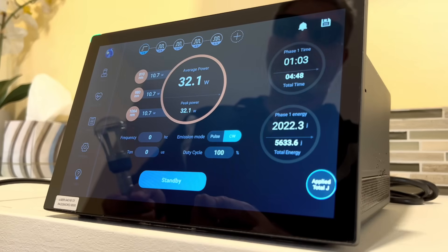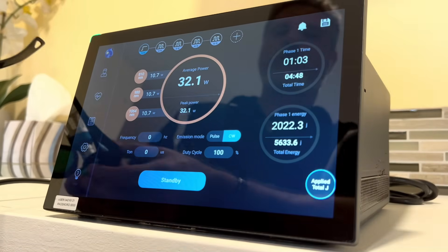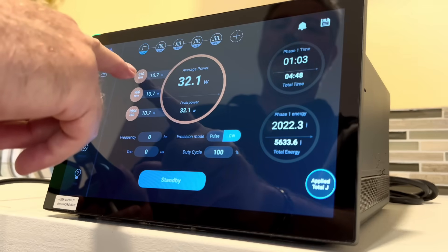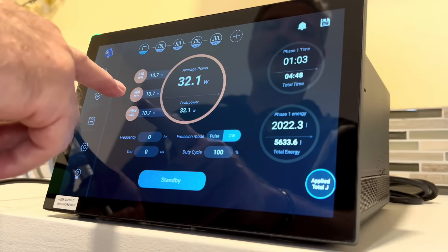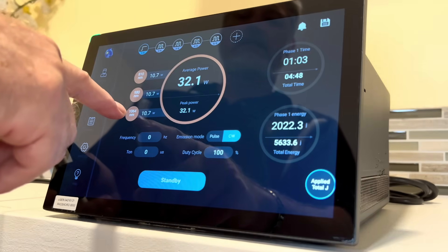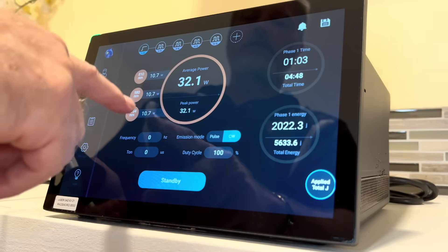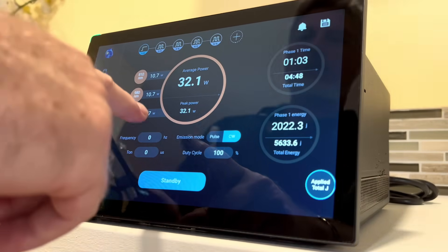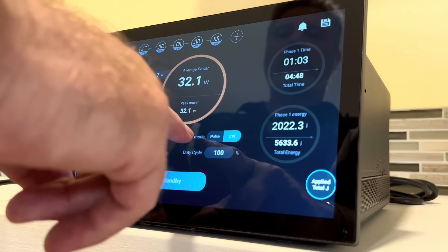Now we have this screen that reveals a lot of important information about the true capabilities of the Remy FX laser. Here are the three different wavelengths: 810 nanometers at 10.7 watts, the 980 nanometer wavelength with another 10.7 watts, and the 1064 nanometer wavelength with an additional 10.7 watts. Remember, each of these three wavelengths can go to a full maximum of 15 watts of power.